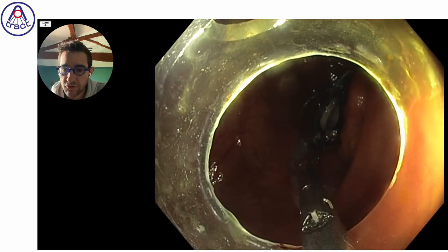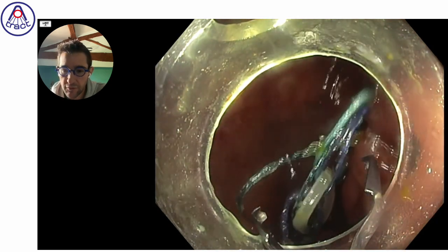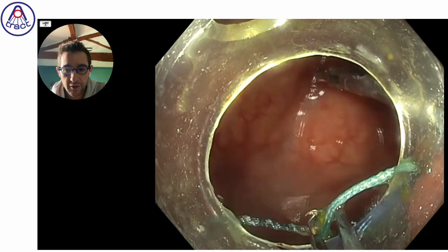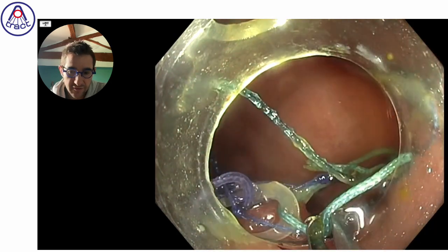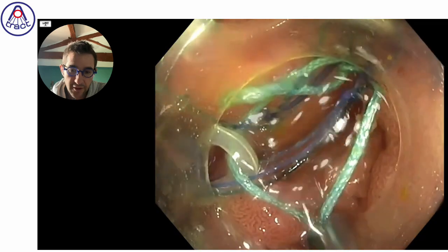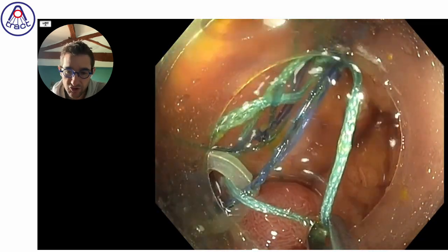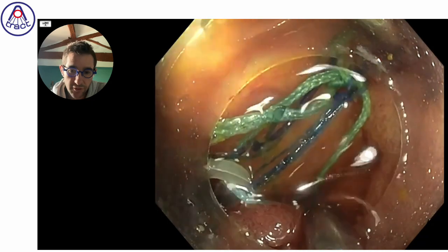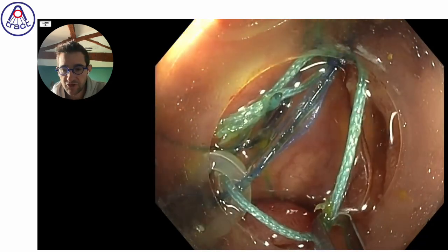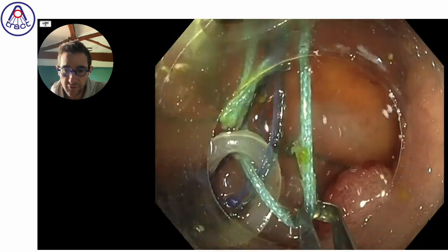But we decided to have a third one on the anal lip, because this anal lip will be a little difficult to dissect. So finally we catch the green free loop in order to have a 3-point multipolar traction on the oral edge. You will see it. And finally, we will just have to fix the rubber band on the opposite wall.